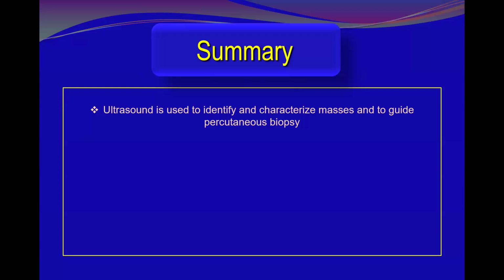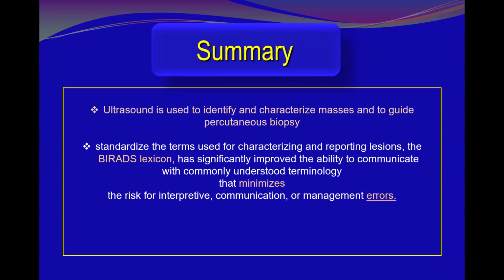Okay, to summarize this discussion: ultrasound is used to identify and characterize breast masses and to guide percutaneous biopsy when indicated. Standardize the terms used for characterizing and reporting lesions.